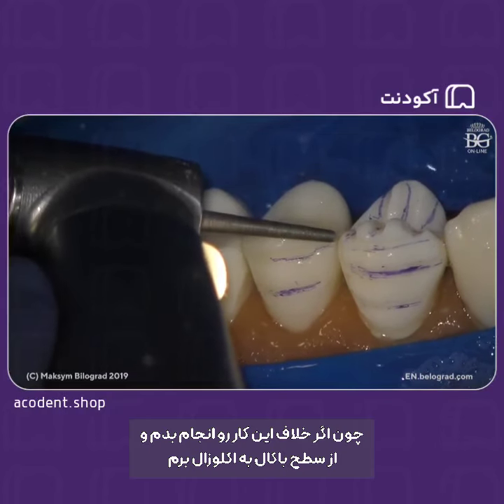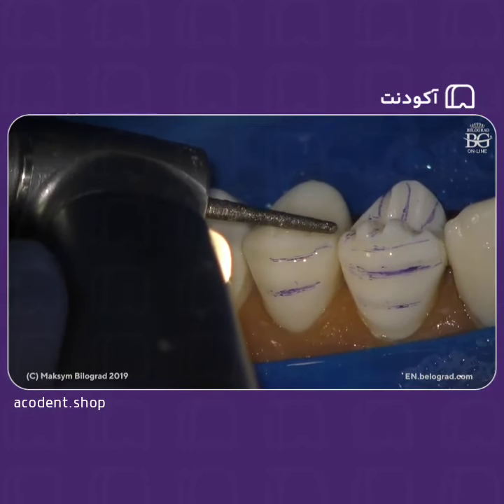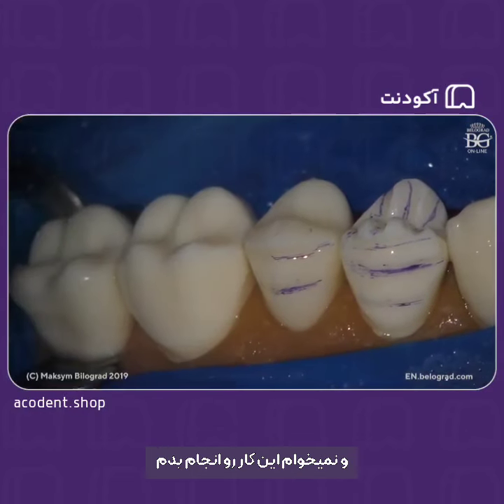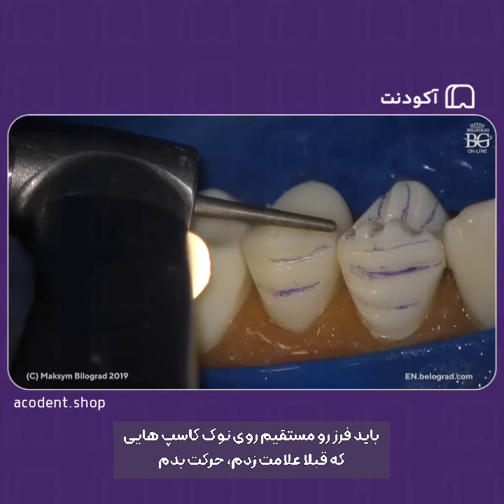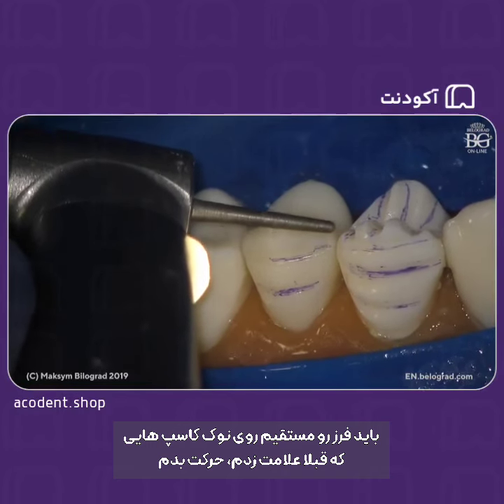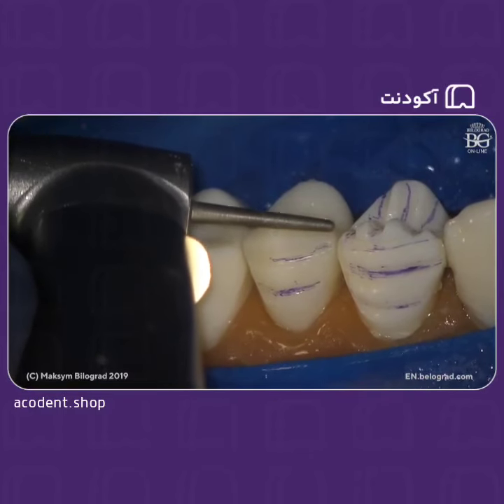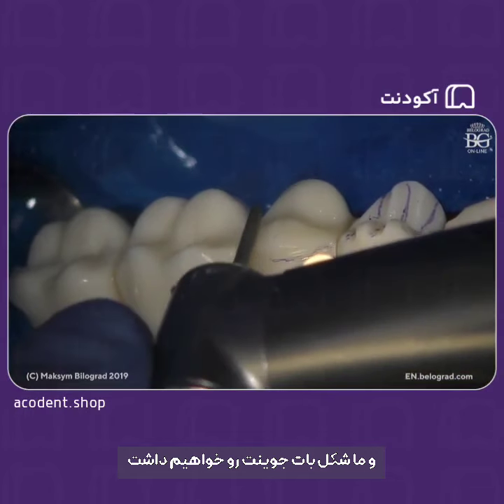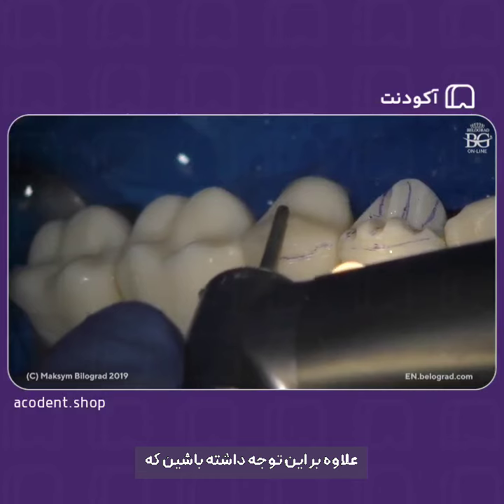Okay, why did I choose that angulation? Because if I do the opposite, for example, from the buccal surface to the grooves, accidentally I can move my burr onto the occlusal surface, and I don't want that. I want to keep my burr straight over the tips of the cusps that we have already marked, and we will have a butt joint.